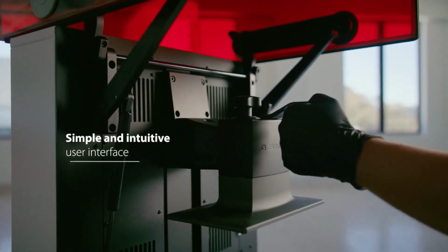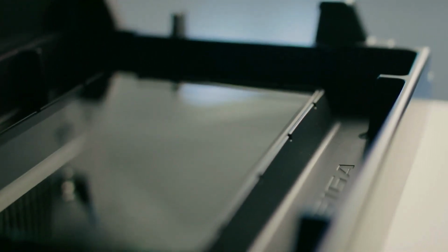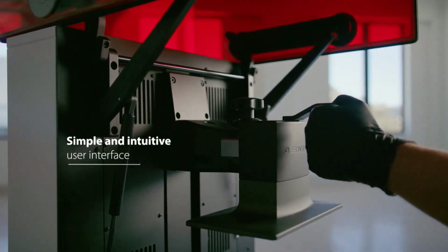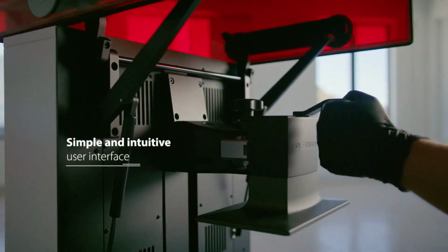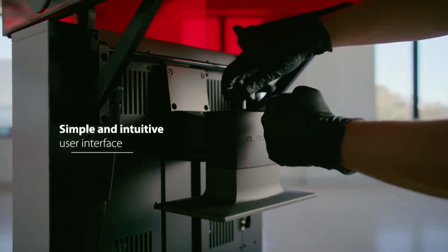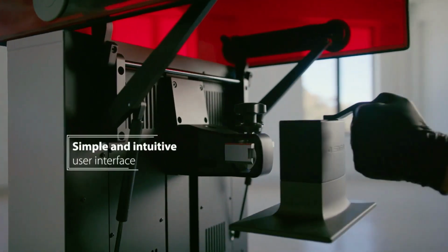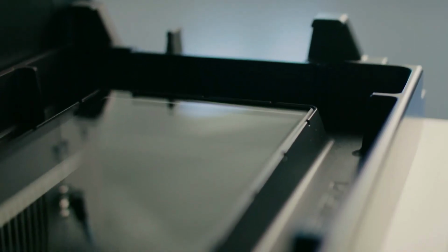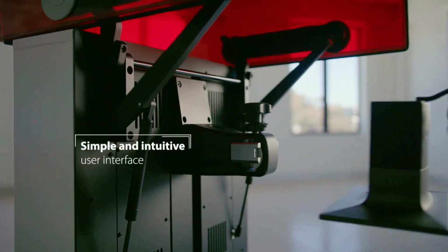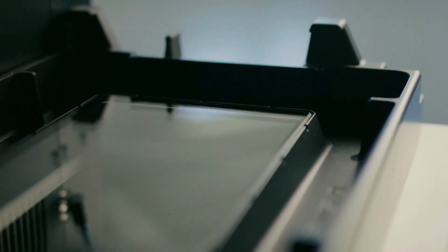And then there's printers that are meant to be really user-friendly that don't allow any kind of calibration at all, right? What they do to kind of overcome that is they press in on their Z depth a little bit more, so they press a little bit harder on the glass, as well as they adjust their burn-in rates to make sure everything adheres to the build platform a little bit better. So you get a little bit less accuracy in the Z-axis on some of those printers that don't have any calibration, right? So I like to, of course, have calibration, but it should be easy and simple to do as well.